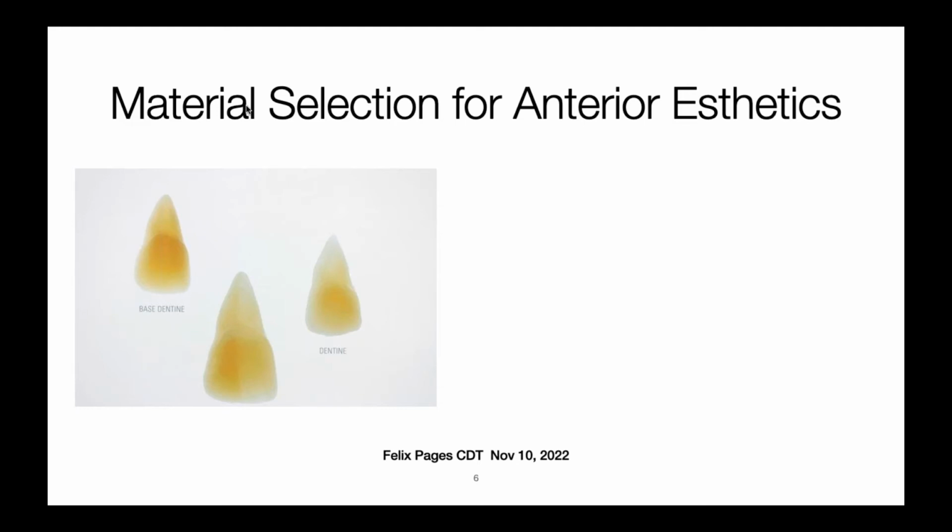And with that said, of course, metals don't allow light to go through them. And so there's special scenarios there where you have to, my concept is the thinner you are, the more that the first layer has to look like the final shade. So you need to have opaques that look like a final shade, copings, frameworks, everything. If you're fighting for room, the very first piece, the skeleton, needs to look really close to the final shade in the position of the colors and the chroma itself.